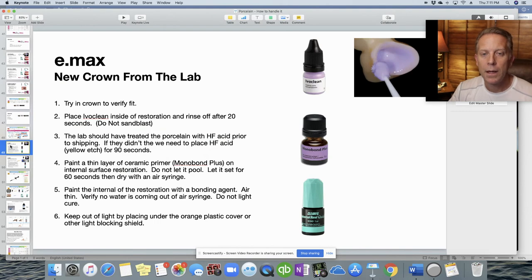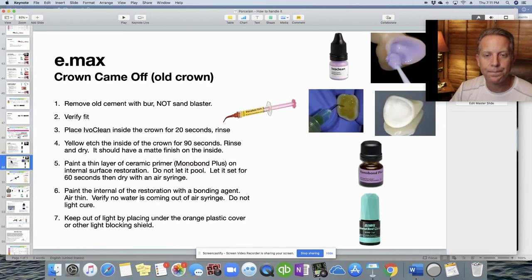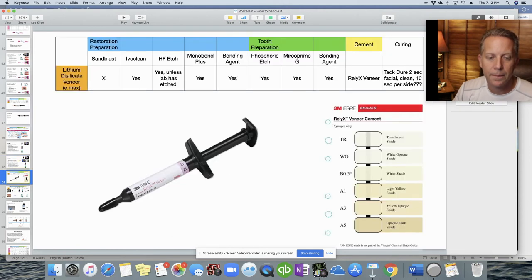For a new Emax crown from the lab: IvoClean the inside, apply Monobond Plus, then use ClearFil Universal Bond Quick on the internal surface — then the crown is ready to go over the tooth. For an Emax crown that has come off: remove the old cement, verify the fit, clean the inside with IvoClean (do not sandblast), then apply hydrofluoric acid etch inside for 90 seconds, wash and dry to see a frosted appearance, apply Monobond Plus, and then the bonding agent.